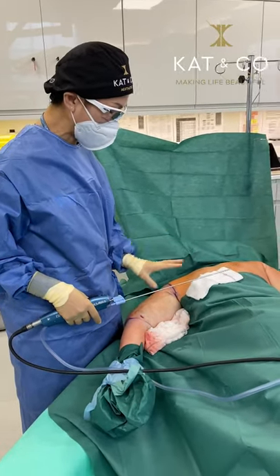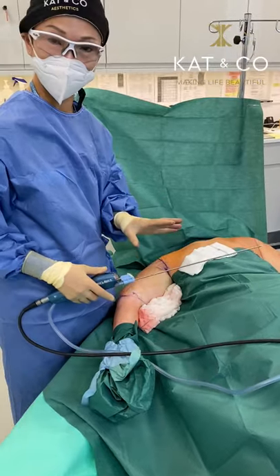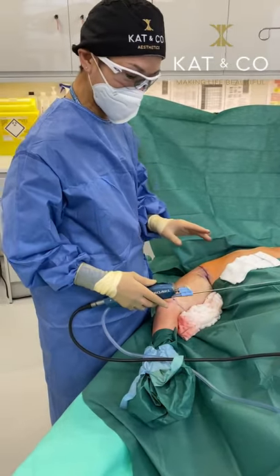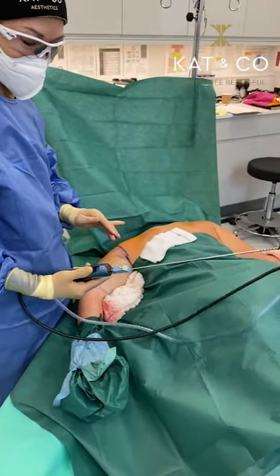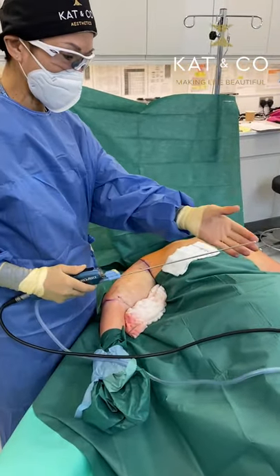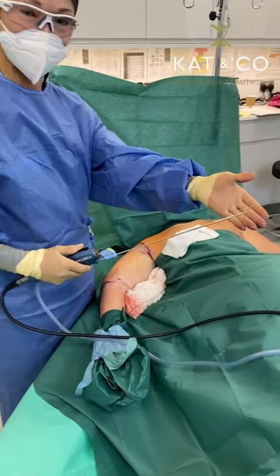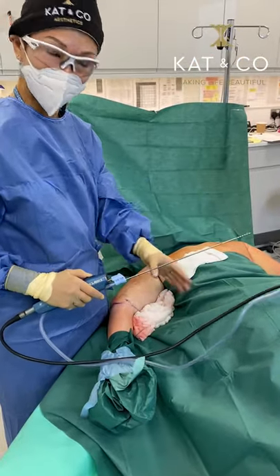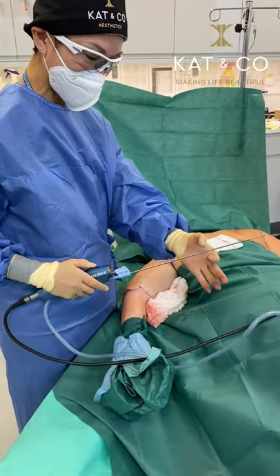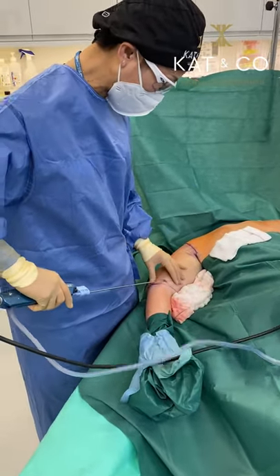We've spent about eight minutes each side using the vaser to melt the fat and I'm now going to suck out the fat. This is called the power assisted liposuction device — it vibrates so that the fat comes out a little bit more effectively. I'm using a very thin cannula for the arm; we use different size cannulas for different areas of the body.